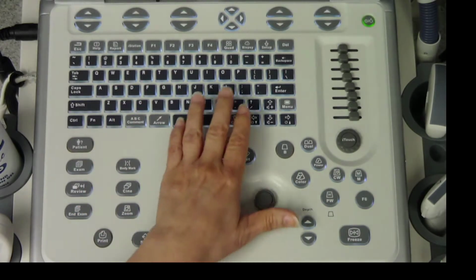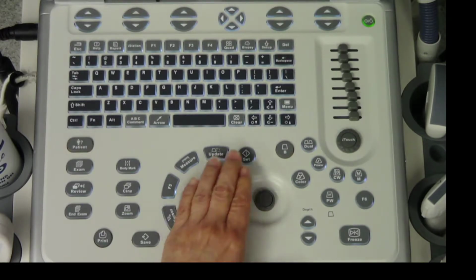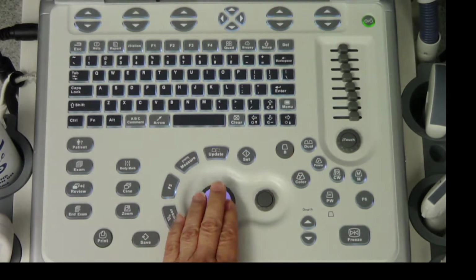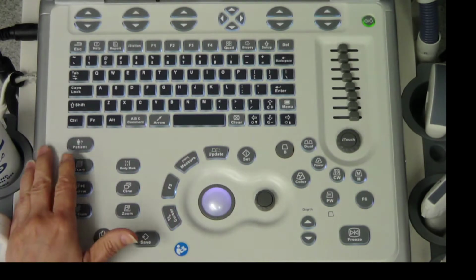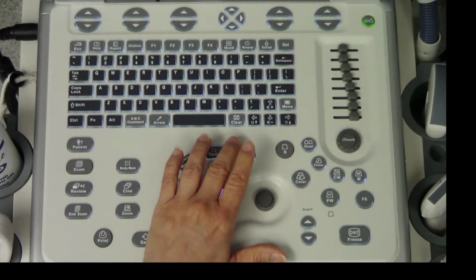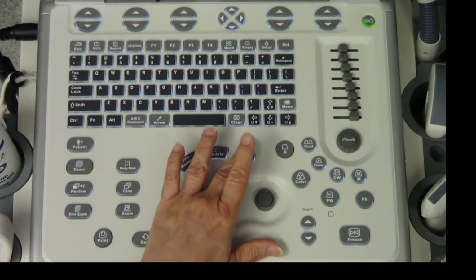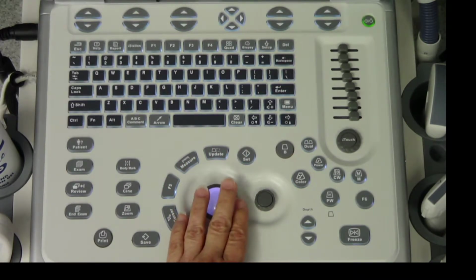And then we're going to hit OK with our set button. And you see that we're already in a linear probe. I'm going to select exam. Now we can choose small parts, and in this case we do have an MSK selection. So you'll want to choose MSK if that choice is given to you. And now we're set up to go.